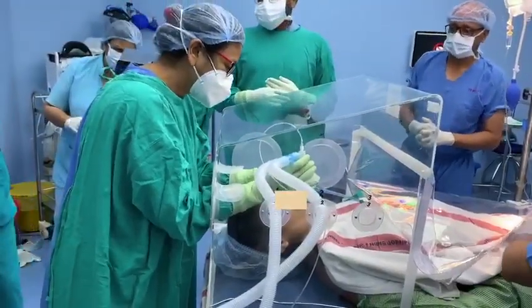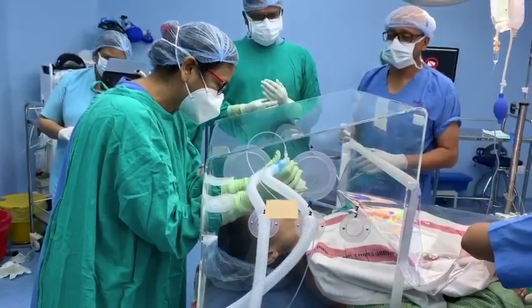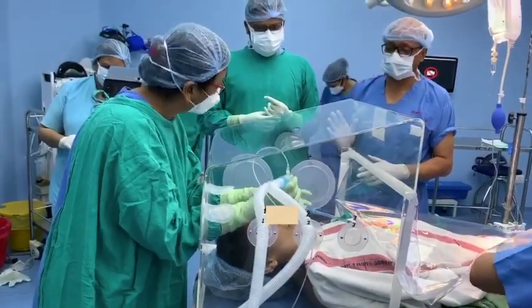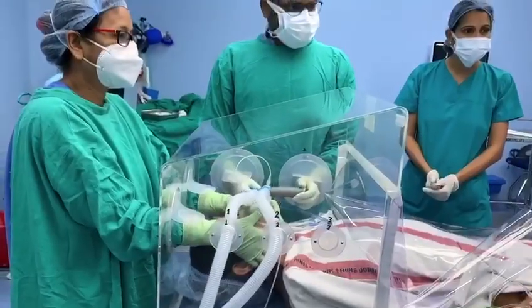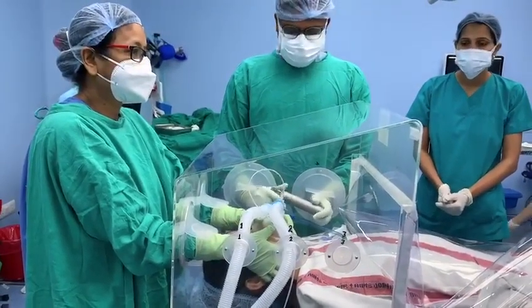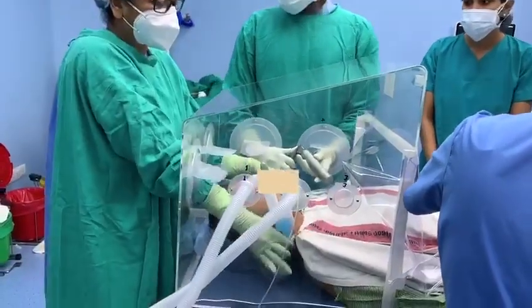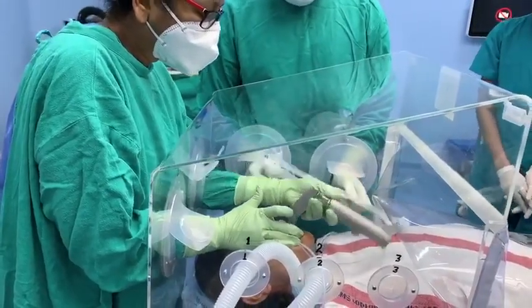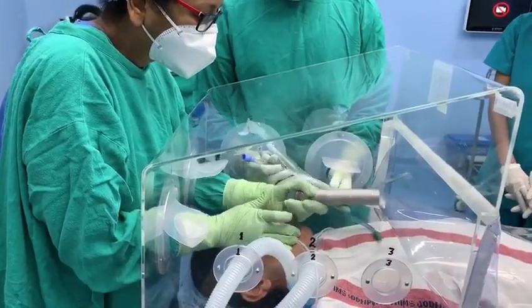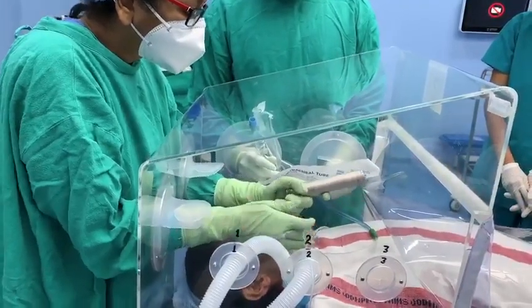It can be easily and quickly detached from the box, and the box can be removed immediately if the need arises. There is an easily and quickly detachable disposable front curtain on the open end, which provides adequate vision of the whole body of the patient while providing a complete seal of the patient's head area. There are two large ports admitting hands for the main intubating physician and two more for the assistant on the side walls.